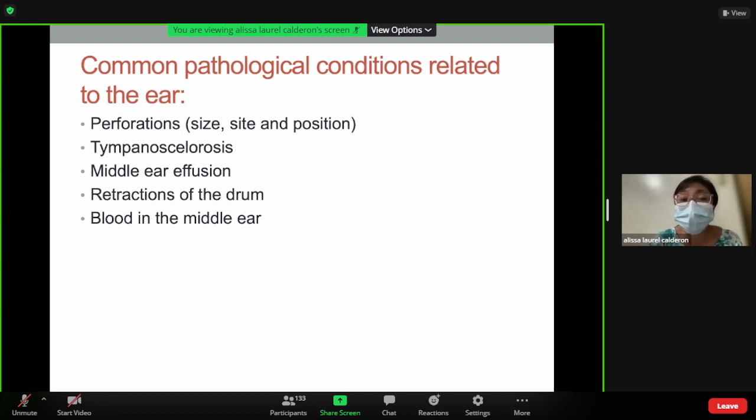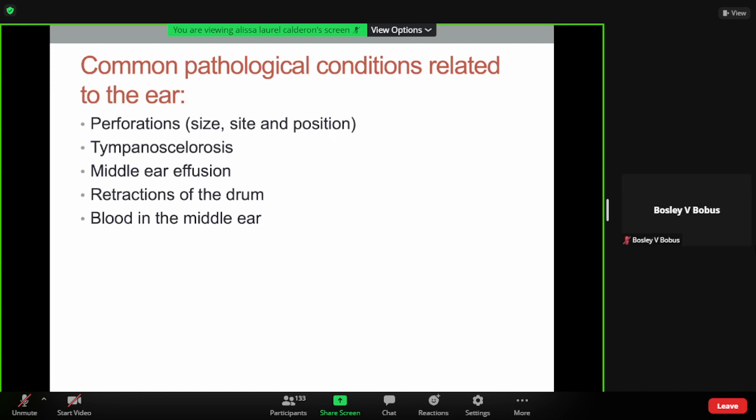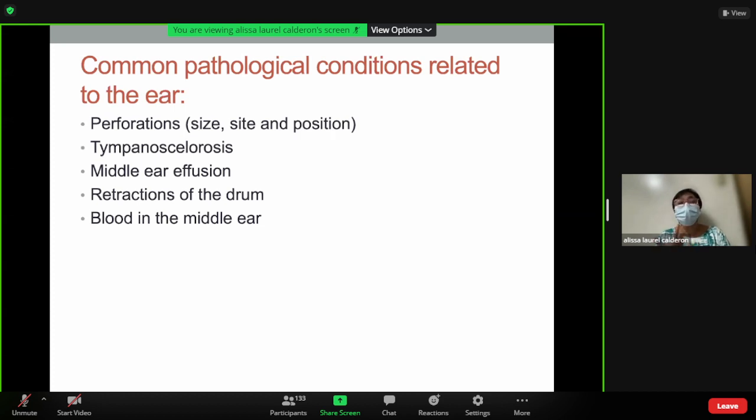Look for the possible middle ear effusion. So sometimes your tympanic membrane is bulging. When you say bulging, the position of your membrane should be flat. But when it is bulging, you can see it's convex in how it looks. So you can consider the possibility of a middle ear infection or otitis media. Or there can be retractions of the drum. If there's a retraction of the drum, then you might suspect a possible previous injury. And of course, blood in the middle ear. So these are the common pathological conditions.